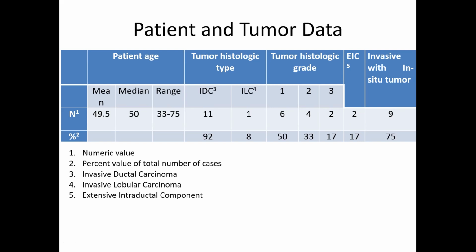disease, which highlights the difficult nature of these cases, which is also the reason that they were referred for the dynamic contrast enhanced studies. At our center, we only do them in cases when both ultrasound and X-ray or mammography provide ambiguous findings. So this was the main reason for all these patients being enrolled. They were not selected especially for our study. These were just going through the standard procedure.